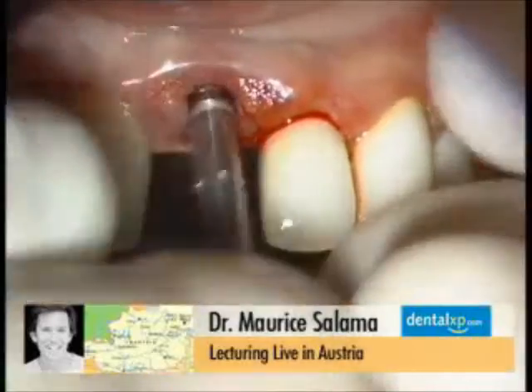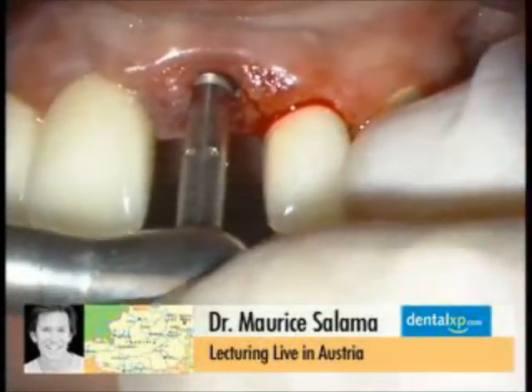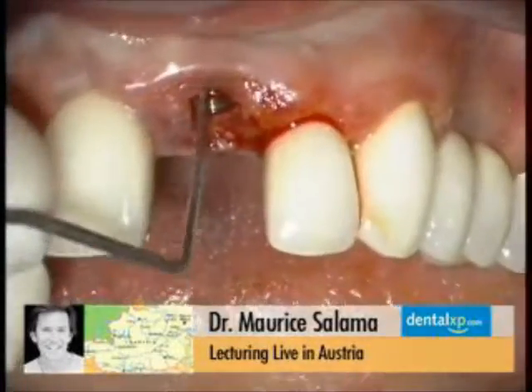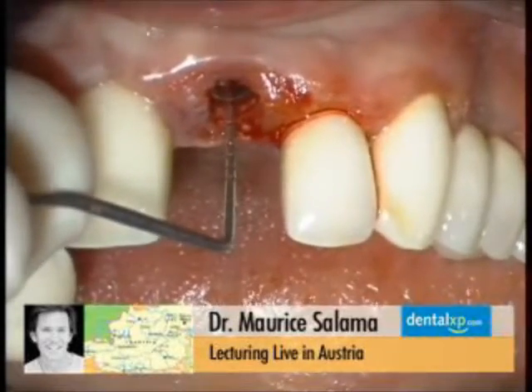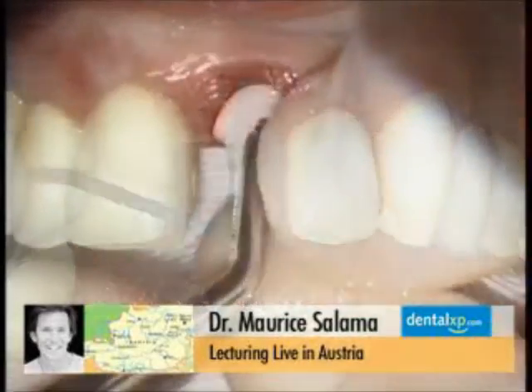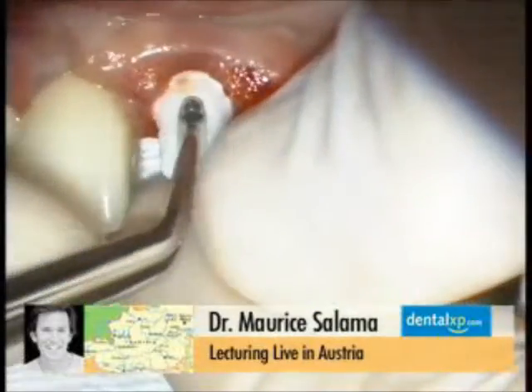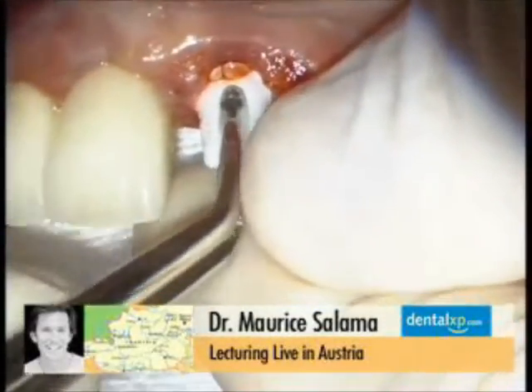And this is what this case looked like when we had replaced the implants, utilizing J-block to shape the soft tissue in the left pontic area. So you can see how we have gone from this situation with a pretty significant defect. Our goal was to come down to this green line, and utilizing a combination of bone and soft tissue grafting and placement of the ankylos implants, you can see that we've been able to recreate the right lateral region and the papillas on either side.